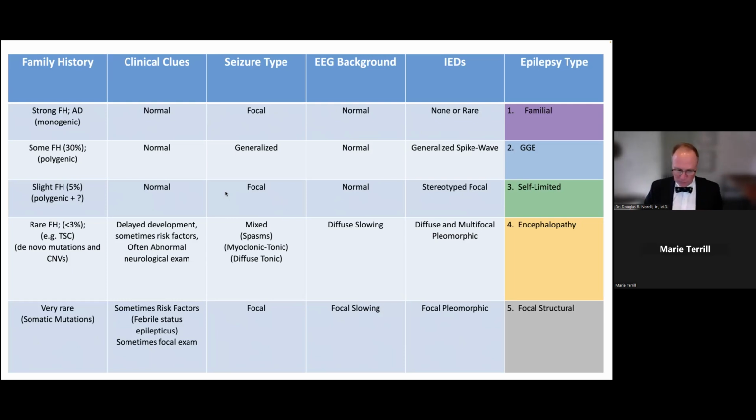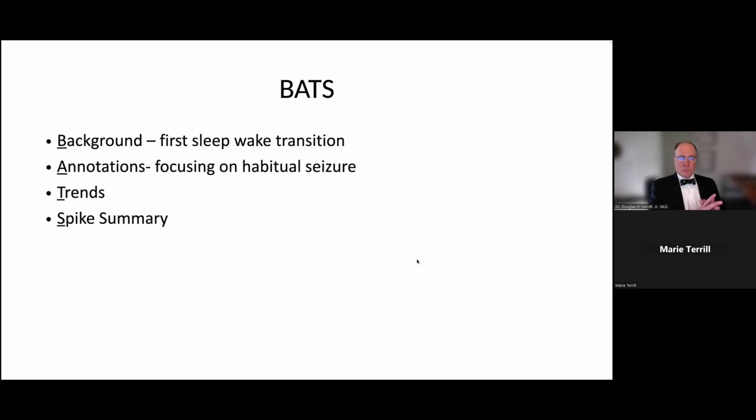I hope it's helpful. As Marie was saying, if this is new, if you haven't heard this description, you can look at it again. You can also reference that article. And I hope it is helpful, but honestly, day to day, I use this all the time. So once I've formed my categorization of how I'm going to approach a child in a second opinion clinic, the next thing that I need to do is review their EEG data after I've reviewed their seizure semiology.